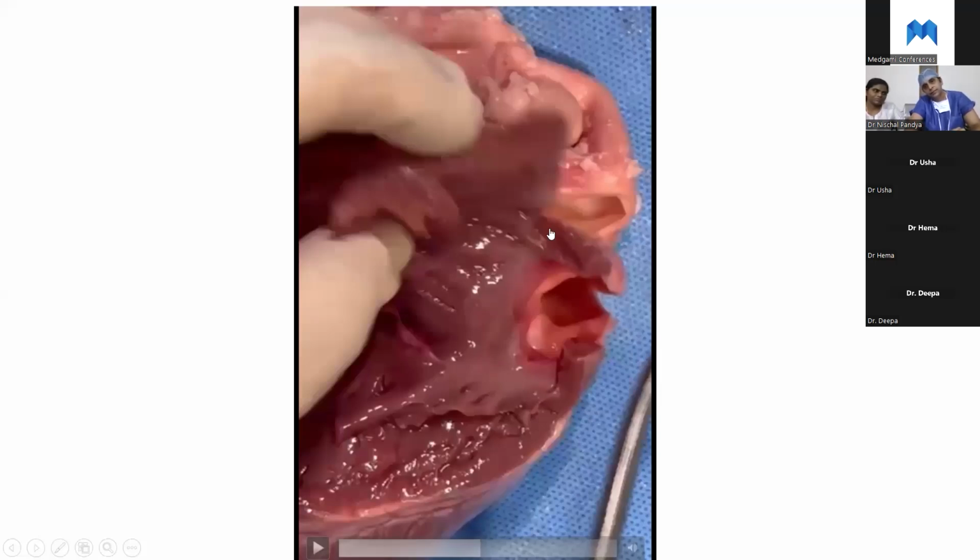the bundles on this end, which get thickened and narrow it anteroposteriorly, are the parietal bundles, which we just split across, cut them. They are not going across into the cavity, but are more just on the wall of the cavity. And that's where we cut them and slice them off and reduce the chunk of muscle there.